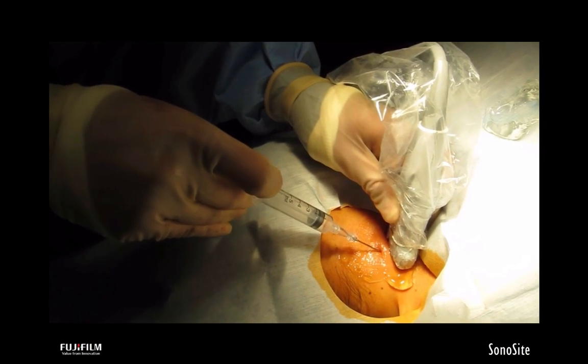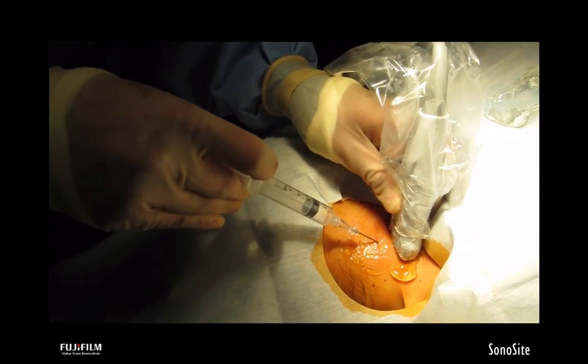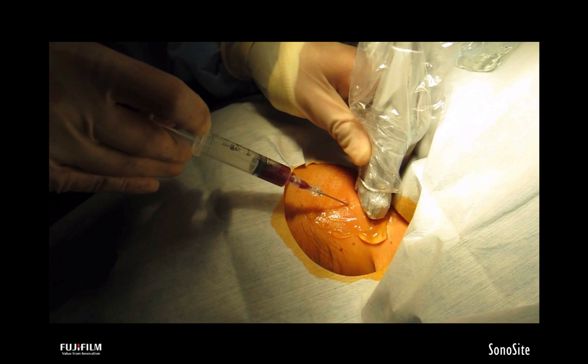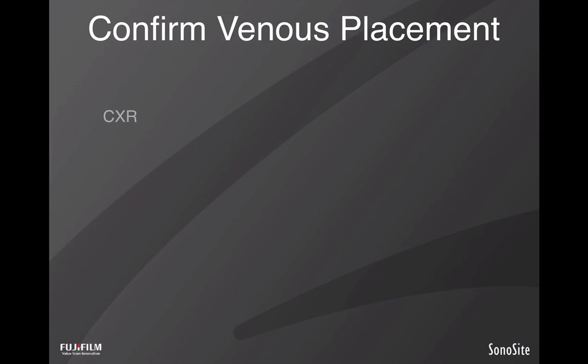Here you can see my resident going in, aspirating, pulling back on that plunger, and boom, she gets access. If the patient's blood pressure is in the 180s and you can clearly see non-pulsatile blood that's nice and dark, it's probably in the vein. But in the hypotensive, sick, septic patient, when the blood pressure is in the 60s, 70s, and you're trying for central venous cannulation, this can be tricky. What I was taught was to check a chest x-ray or a venous blood gas. Again, not 100% accurate. I think these are incorrect. Central venous pressure is a great test.